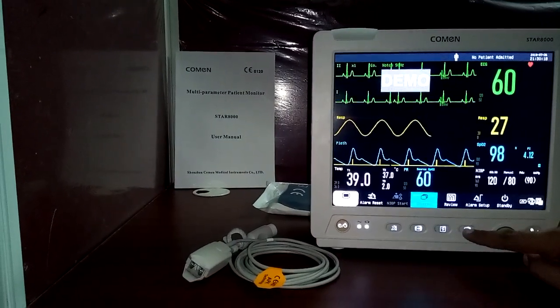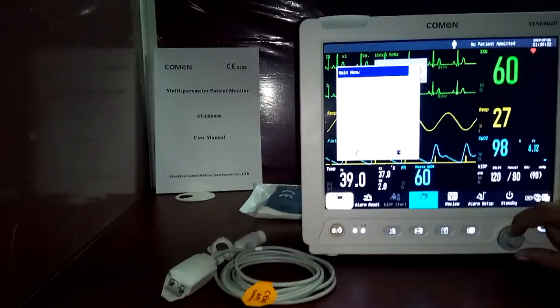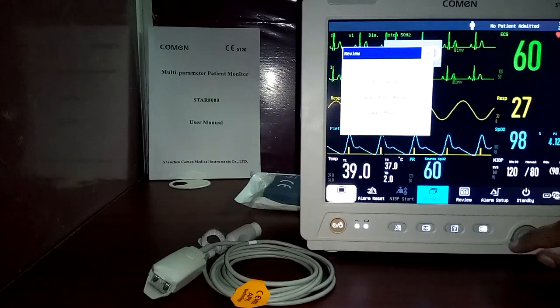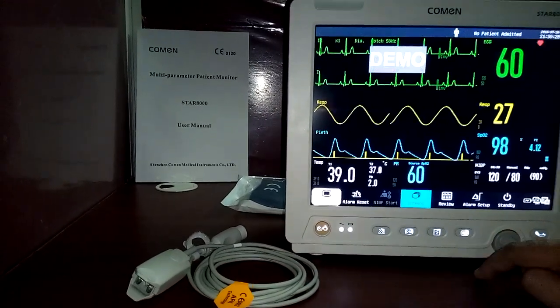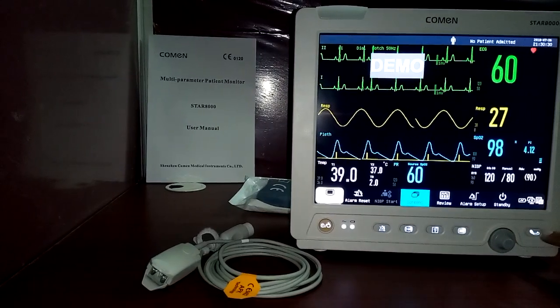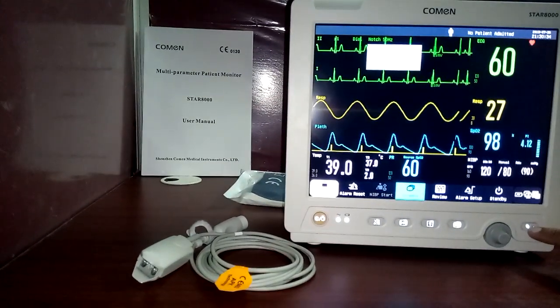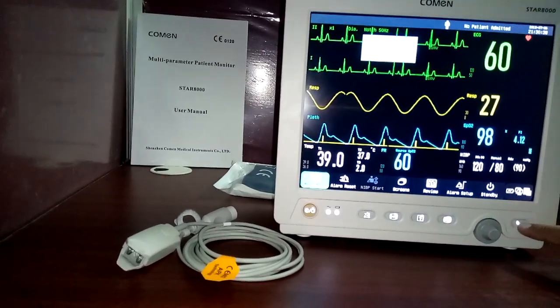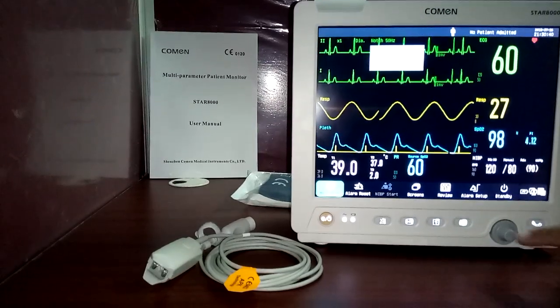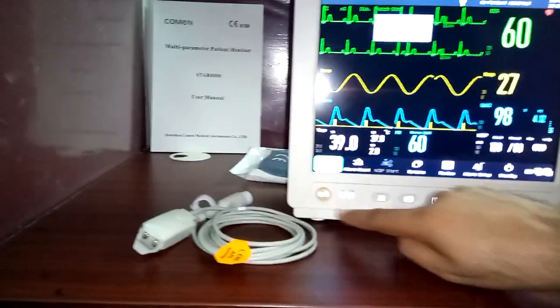This is the home key. If you are inside any menu — such as review or settings — just press this button and you will return to the home screen. This is the NIBP manual key; when you press this button, it will start the NIBP measurement. This is the main power on/off button.